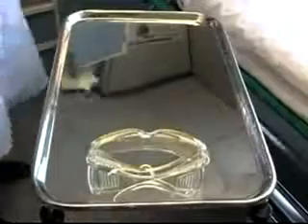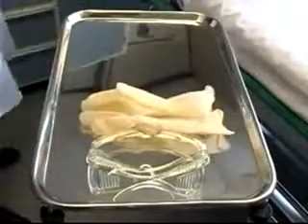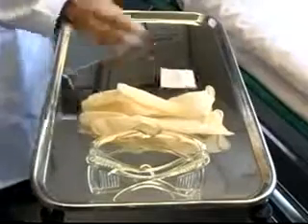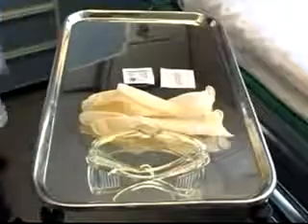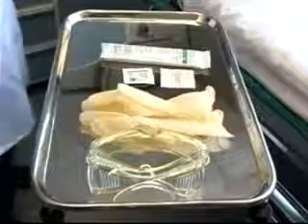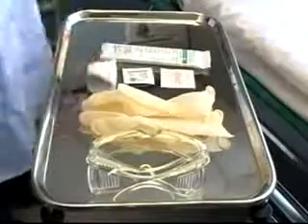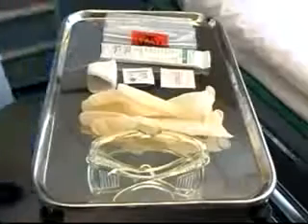The equipment necessary for arterial blood gas sampling includes protective eyewear and gloves for universal precautions, a Povidone-iodine swab followed by an alcohol swab, an arterial blood gas sampling kit, 2x2 gauze, and a bag of ice to put the sample on to send to the lab.